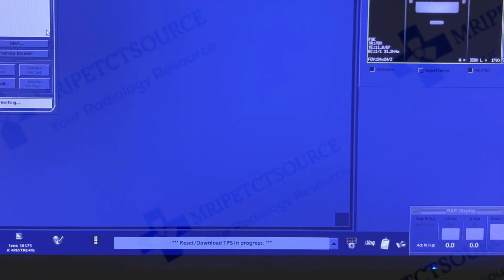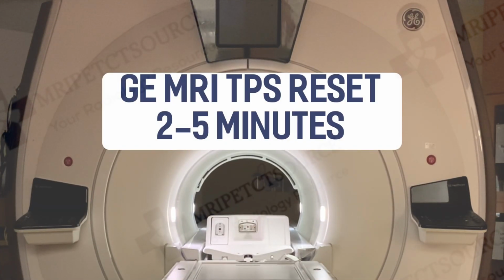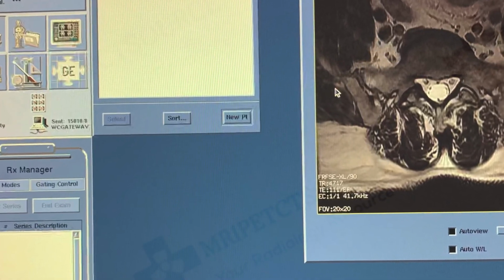At this point, you may notice your message log reads reset TPS in progress. The GE MRI TPS reset process can take up to 5 minutes to complete. Once the reset is complete, the message log should read, TPS reset was successful. Your GE MRI system has been reset and is ready to begin a new patient.